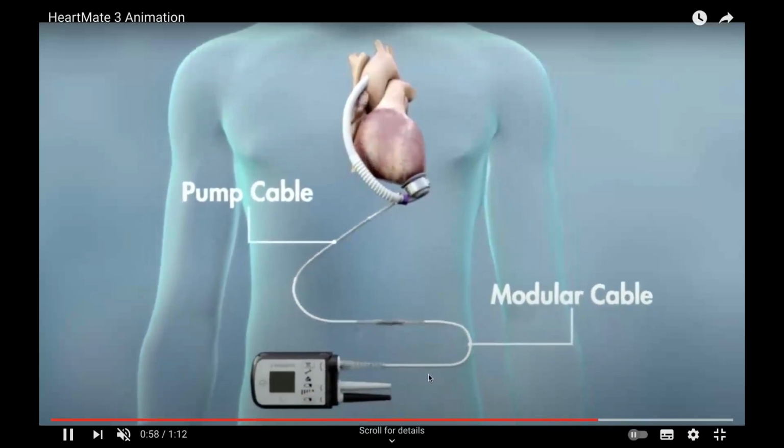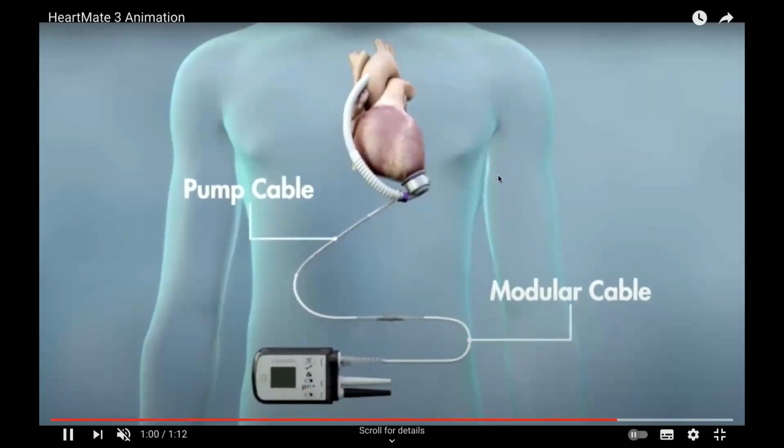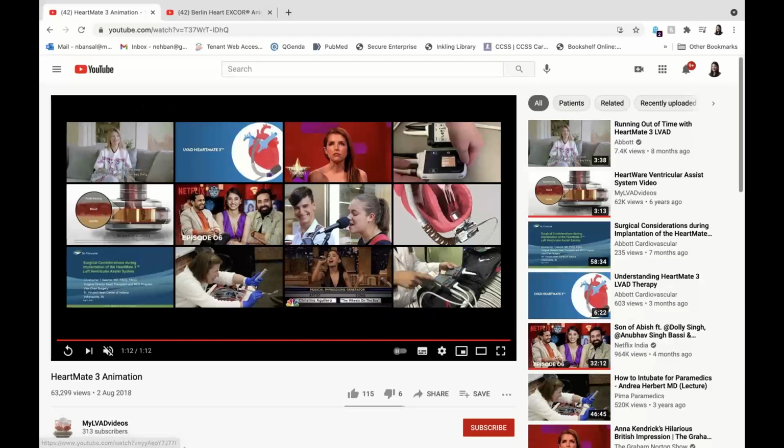So this is the pump cable, and this is the modular cable, or the driveline, and they connect to this controller, which is outside the body. Somewhere along the way this cable gets threaded outside the body, and you have this controller that sits outside the body.